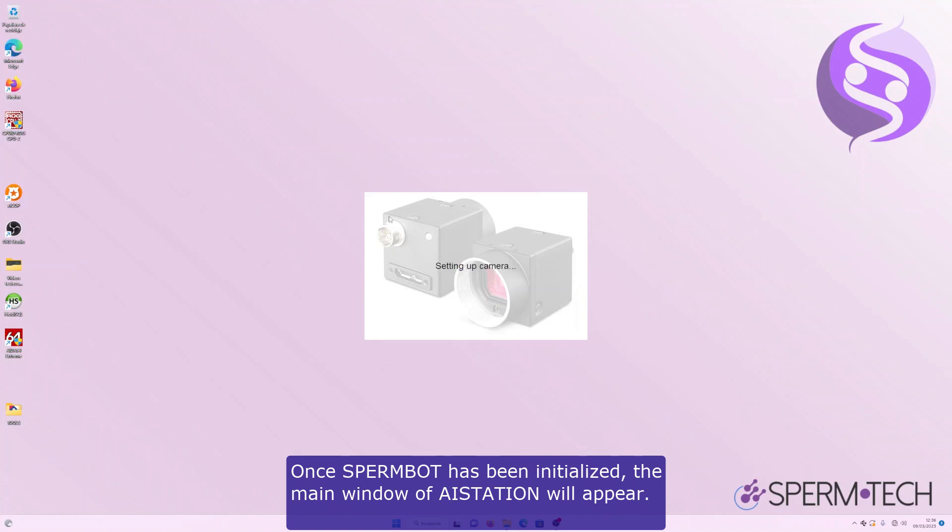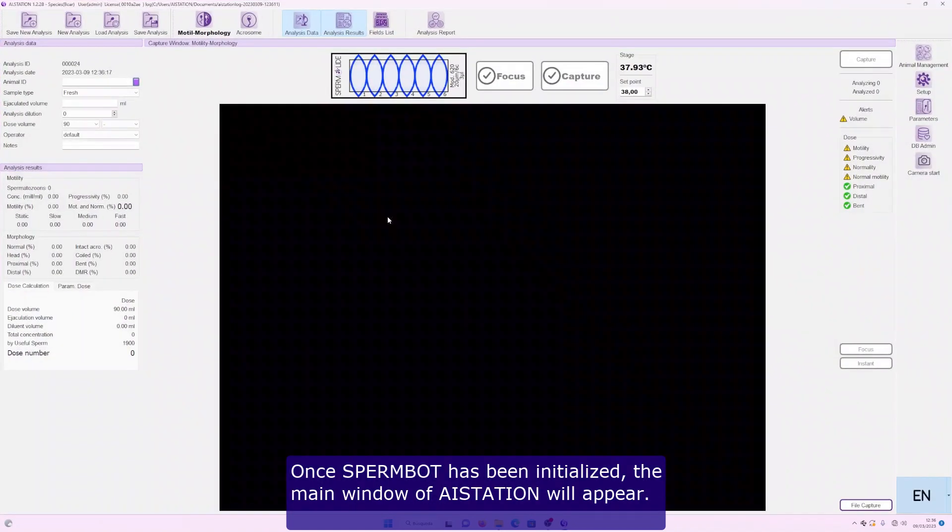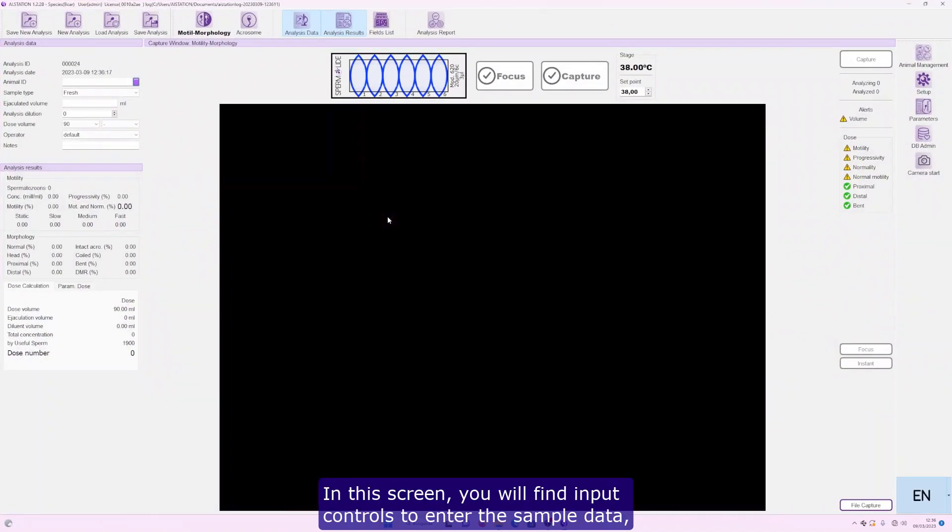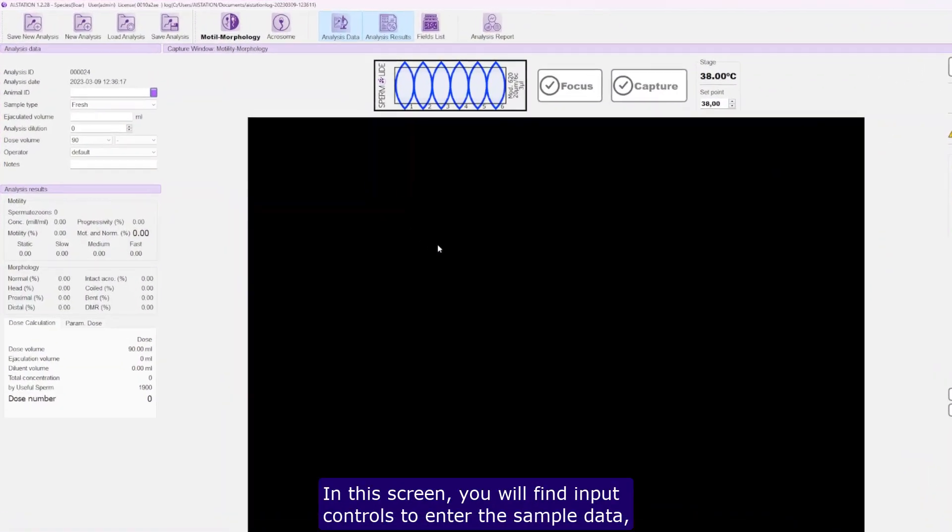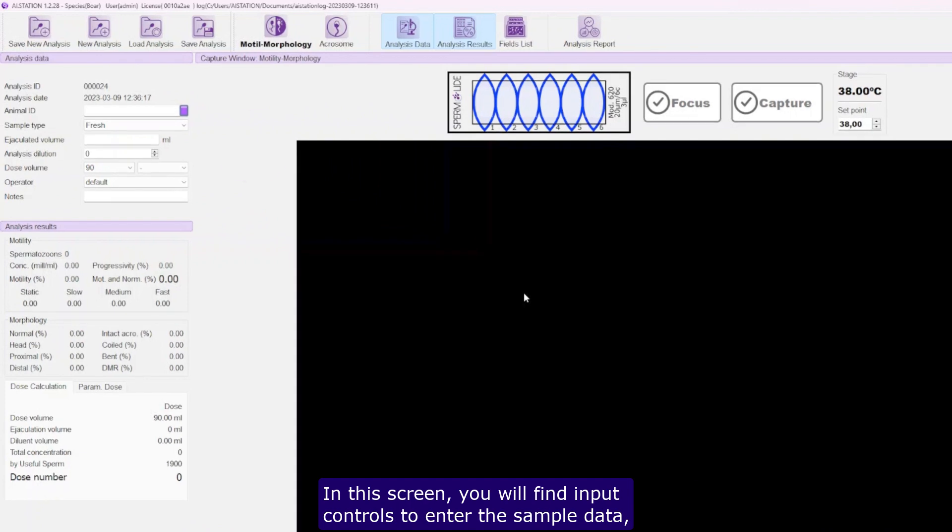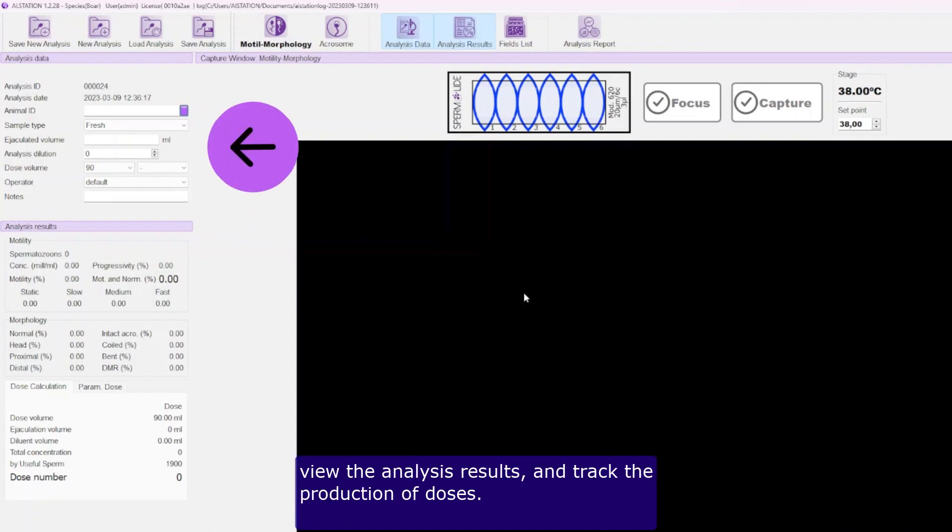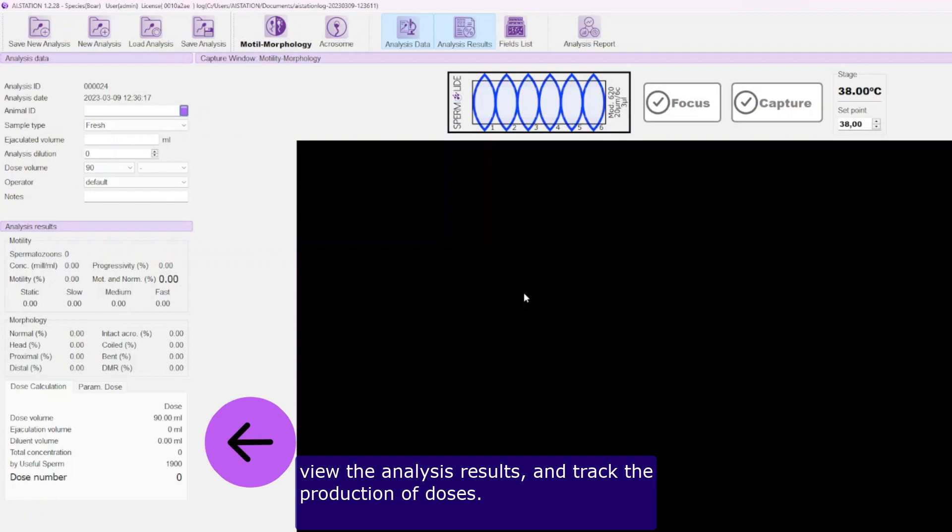Once Spermbot has been initialized, the main window of AStation will appear. In this screen, you will find input controls to enter the sample data, view the analysis results, and track the production of doses.